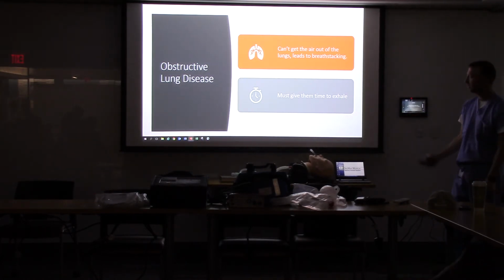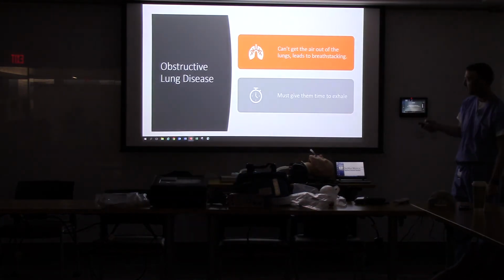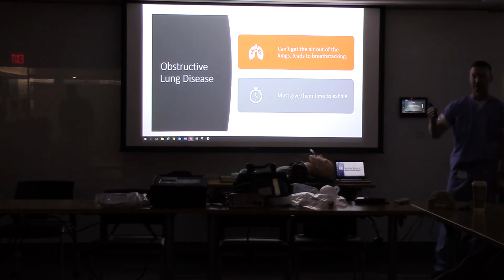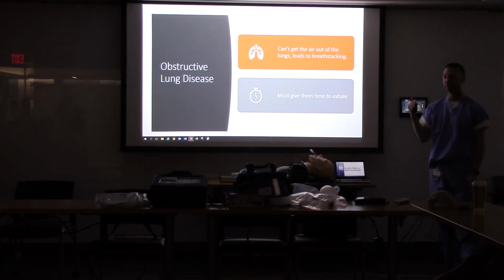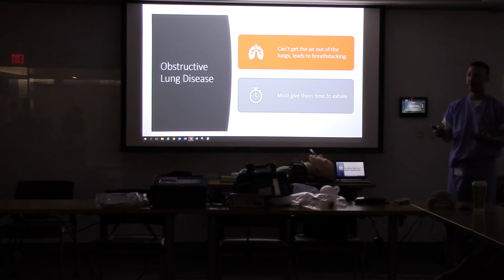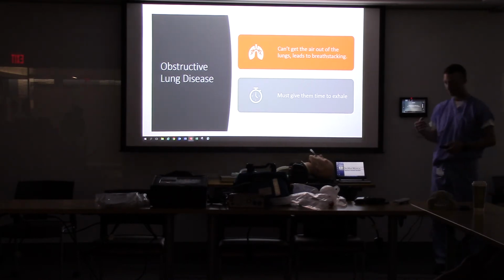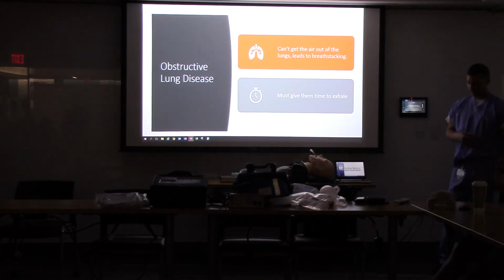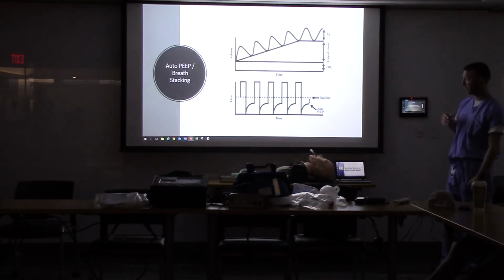So what we generally do is get some air in, leave it and let them breathe out, and then give them another breath. You actually will do what's called permissive hypercapnia, meaning you allow them to have higher than normal end tidal CO2s or blood CO2 levels, so that you don't breath stack them.